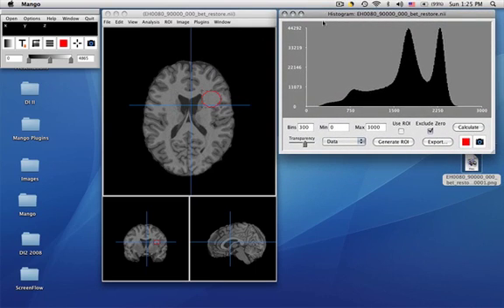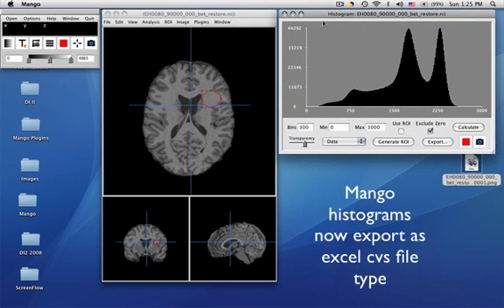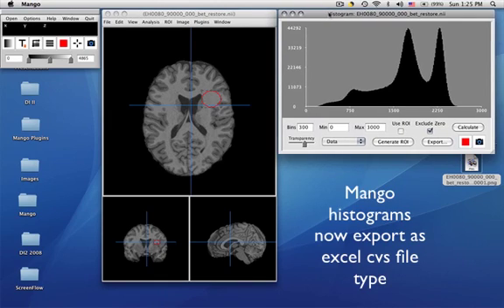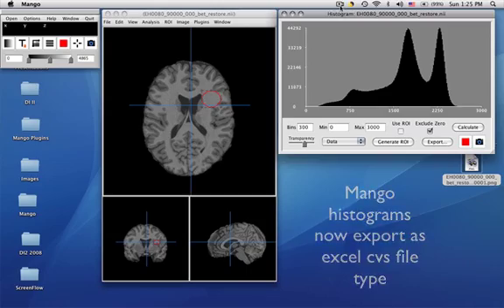So these are most of the features for histogram in Mango. We continually upgrade these. So you'll have to read through the manual to check to see what the latest features are.